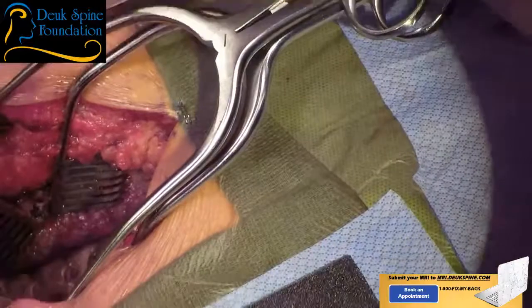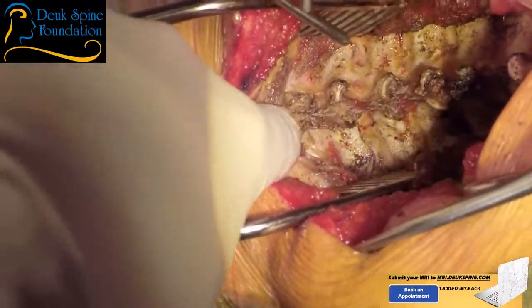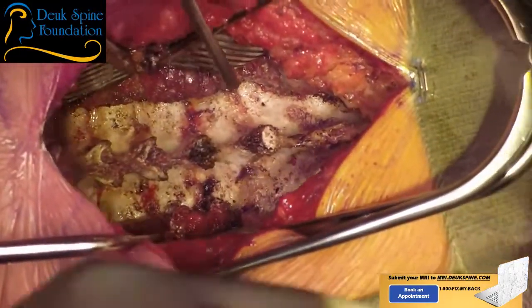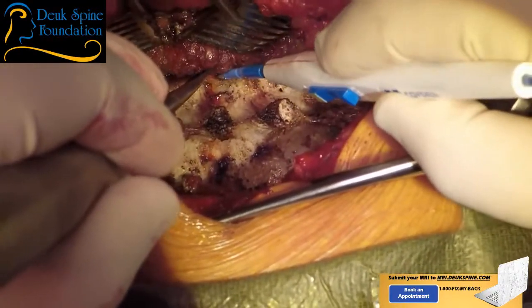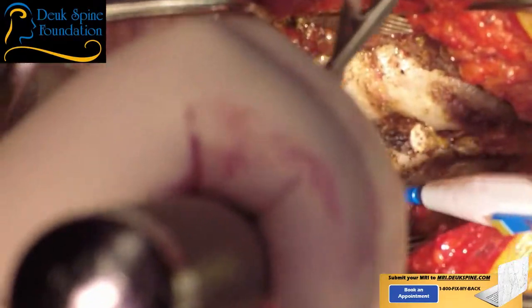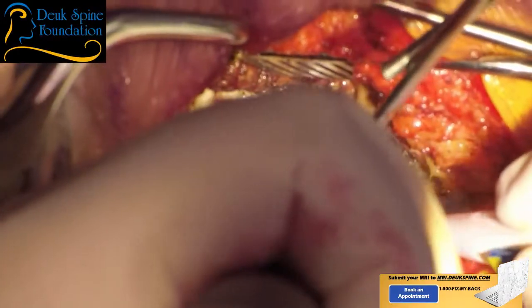All right, now I'm just going to verify. This is C2. That would be 3, 4, 5, 6, 7, T1 and T2. I see the transverse process of T1 and T2. I don't see a transverse process here. I don't see a transverse process here, so that has to be 7. The next one is T1, and the one after is T2.